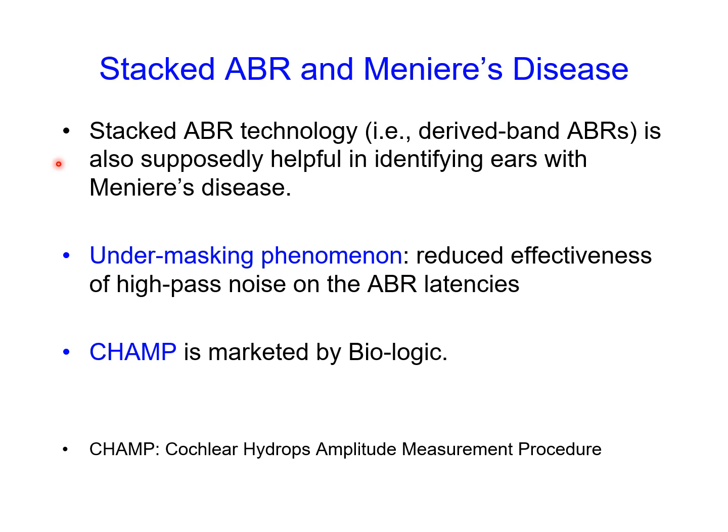Before we can get to details and how it works, we need to understand a phenomenon called the under-masking phenomenon. It's basically a reduced effectiveness of high-pass noise on the ABR latency in response to click stimuli.